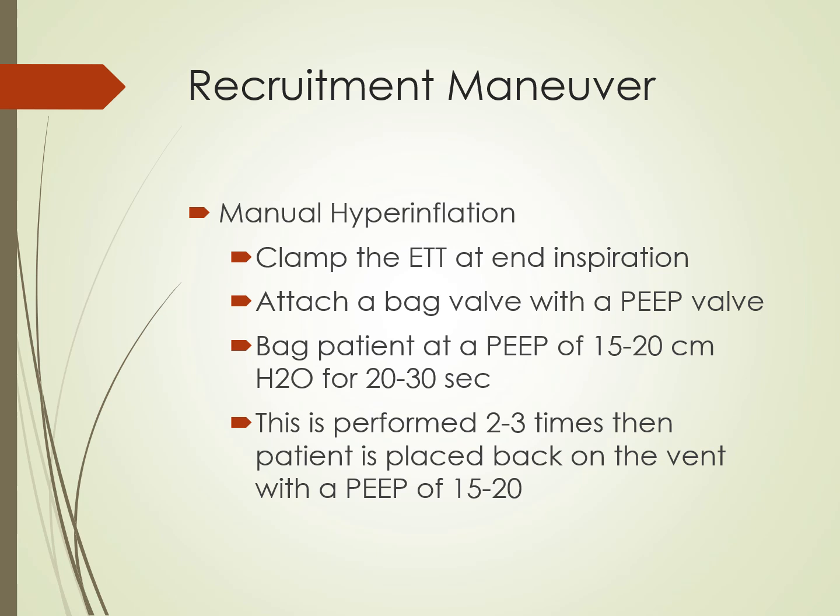So the goal is to inflate the lung, hold that inflation with a PEEP valve for about 30 seconds, then put the patient back on a ventilator at a higher PEEP level of 15 to 20, but you do this maneuver 2 to 3 times, and it really works rather well.